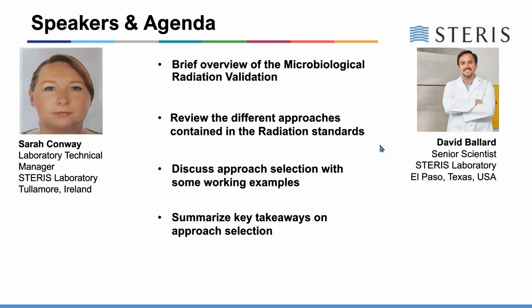While this presentation predominantly looks at the microbiological testing used to establish the minimum dose, it also touches on the importance of maximum dose testing. However, it does not look in depth on this topic or other aspects of the radiation processing or validation. For more information on these topics, please visit steris-ast.com. An additional note throughout this webinar, when we talk about sterility assurance, we'll be referring to a sterility assurance level, a SAL, of 10 to the minus 6. However, it should be noted that other sterility assurance levels can be validated.